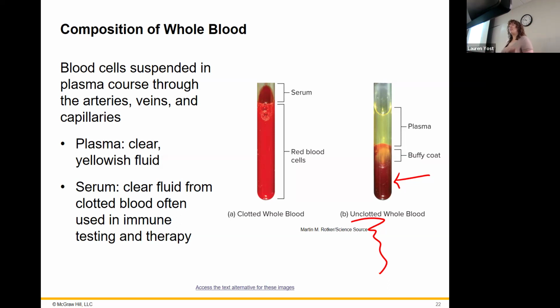When I'm talking about serum, I'm talking about letting the blood actually clot. So you'll send me a tube. There'll be a red top tube or a tiger top tube, and I'll let it sit out. They'll send it to me, and I'll have it sitting out on my desk. You might even walk up to the lab later and see it sitting there, and be like, you haven't run my tube yet, and I'm like, yeah, honey, I'm waiting for it to clot.